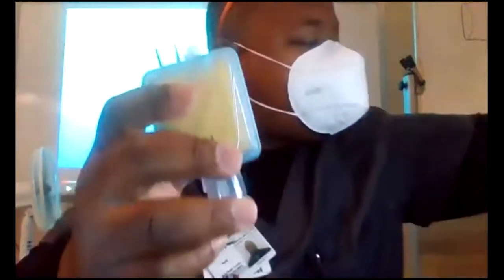This is a heat and moisture exchanger. The CO2 and all that's not an issue. That's not something you have to worry about. This is also a heat moisture exchanger. Same thing, just a different way it's made. Blow into it, suck back in, and it's going to give you your heat and your moisture right back.